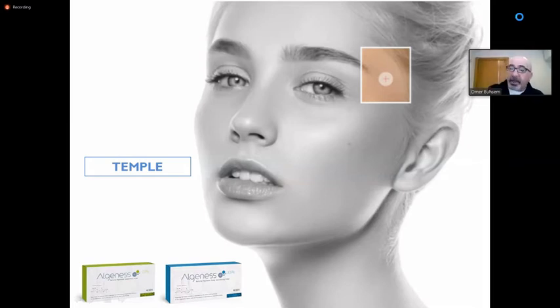But always, I try to dissect where I am injecting, and do it with a cannula, dissect the fibrosis, create a space, and inject, and then leave it. I have some patients I have followed up for 3 years. They came to me with a really big deviation or deformity. I said yes, you need an operation, but it's really early now. We can do camouflage with fillers, and 1 year later we can do the operation. And for 3 years, they are still good, no problem. So in the early stage, if you inject to correct some deformities, it may be a permanent correction.